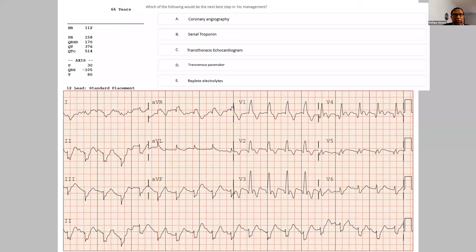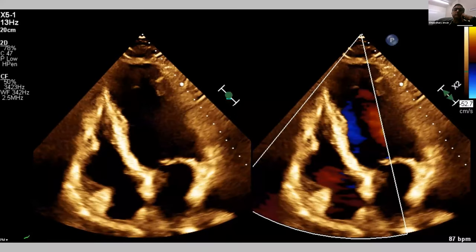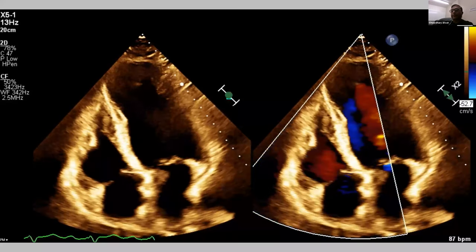First of all, this is a patient with chest pain, right? Yeah. And has stage 4 pancreatic cancer. Yeah, so that part is important. But from my blind sense, how old is the patient? 66. I'll probably do an angiogram, see what's going on. Yeah, so that's what we did. But we also did an echo on the way.